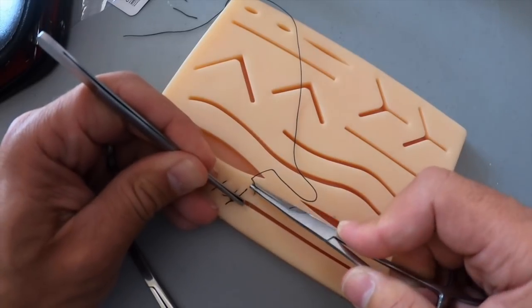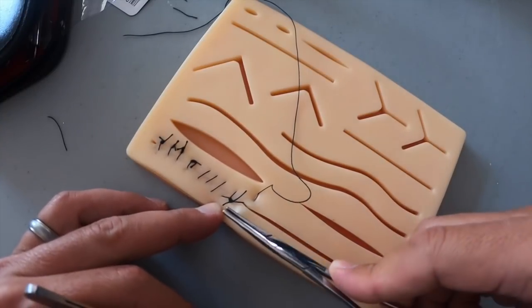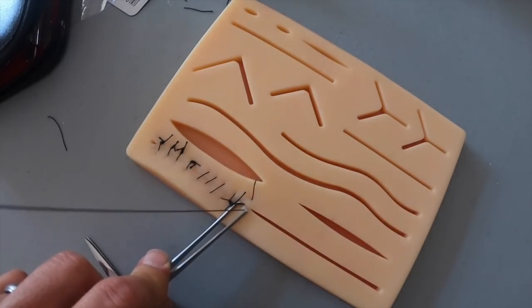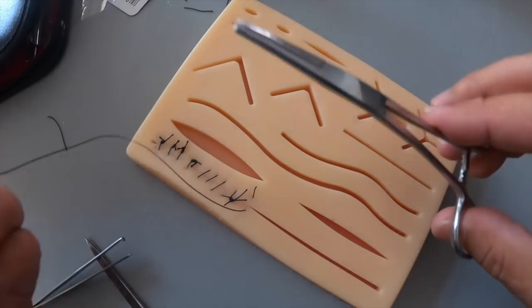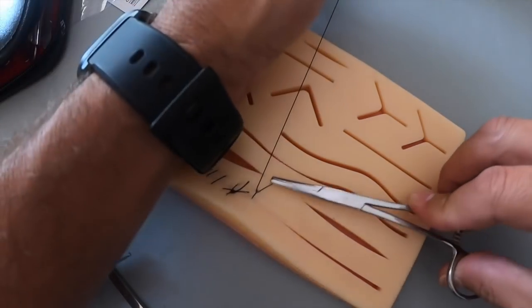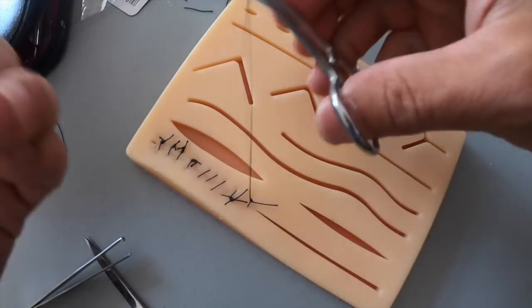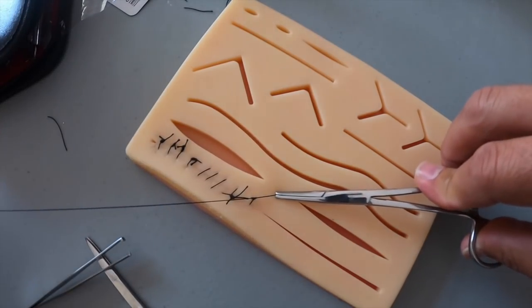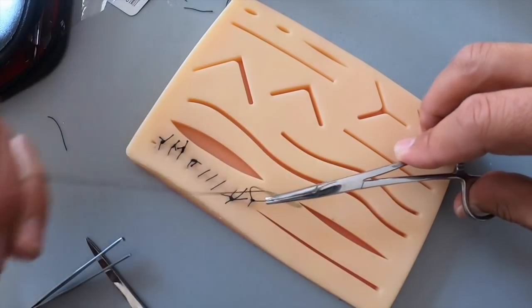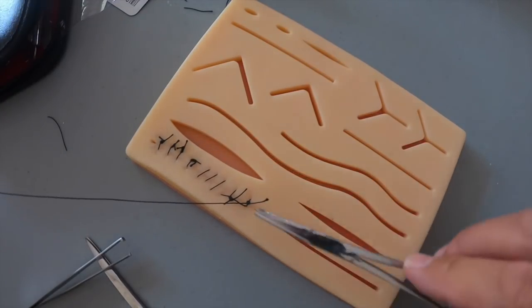Use the forceps to help you pull through, and just like before we're going to do two times forward for a surgeon's knot. Pull and hold and forward, and that's one. And backwards two and forward three and backwards, and the last one should be fine, nice and tight.